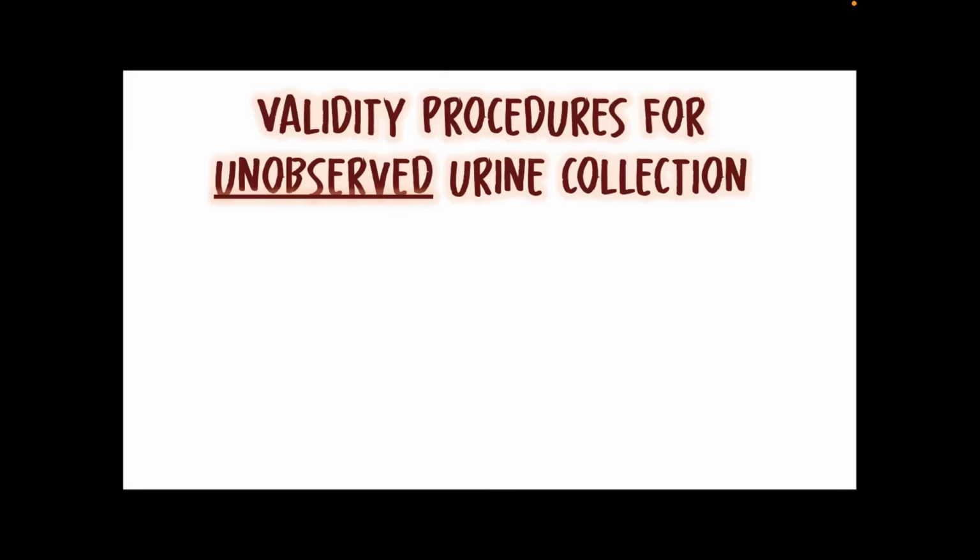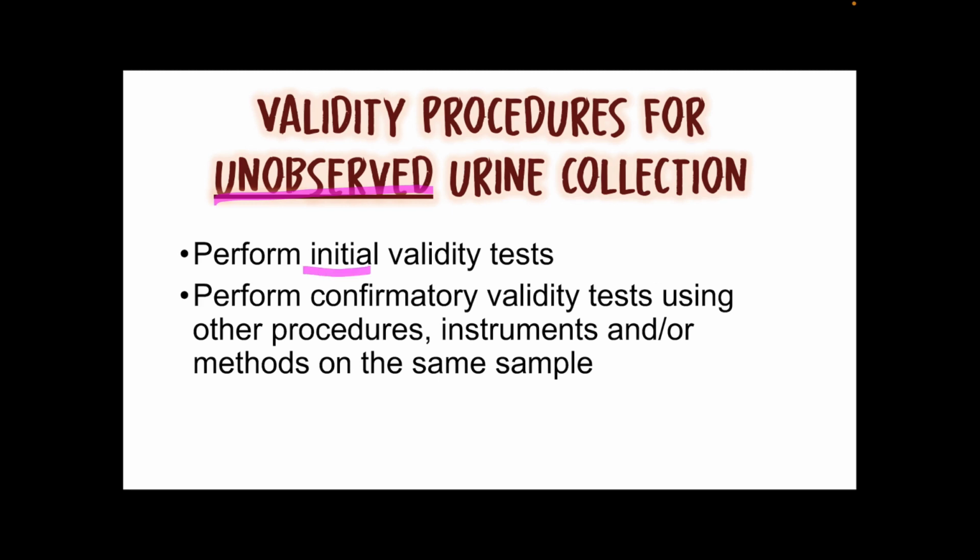For the validity procedures for unobserved urine collection, there must be an initial validity test followed by a confirmatory validity test using other procedures, instruments, and methods on the same sample.